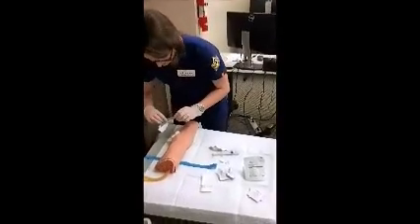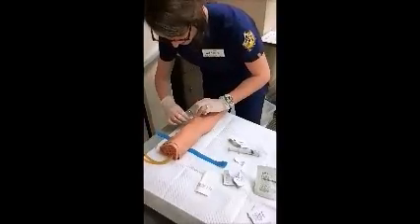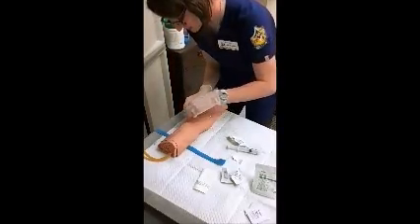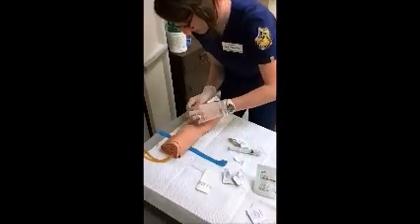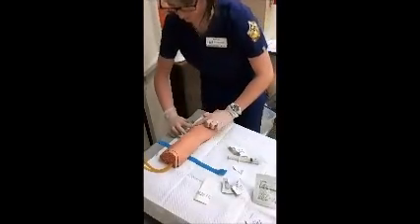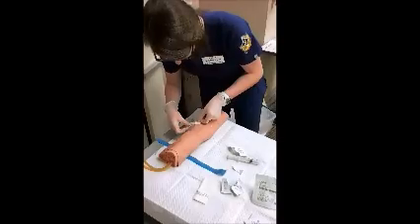And using our tape, we can also shimmy this under here as well, and being very sure to not occlude the entrance of the catheter and just stabilizing that. We want to be able to always see that catheter site. That is very important. And then I'll place another piece of tape as well, just right around there.